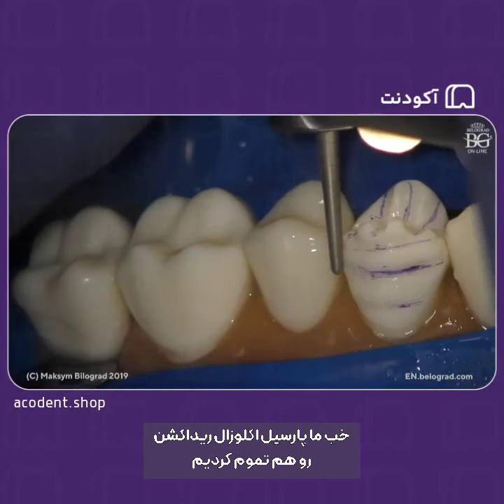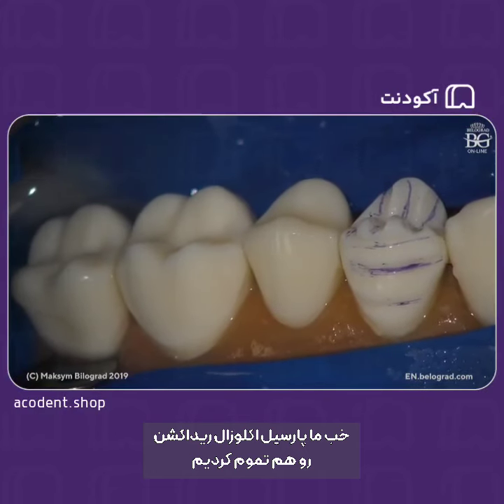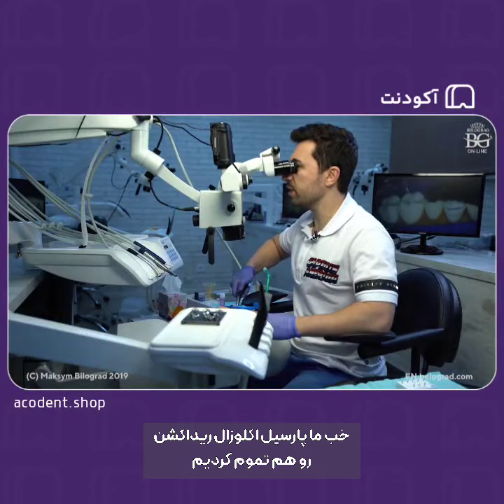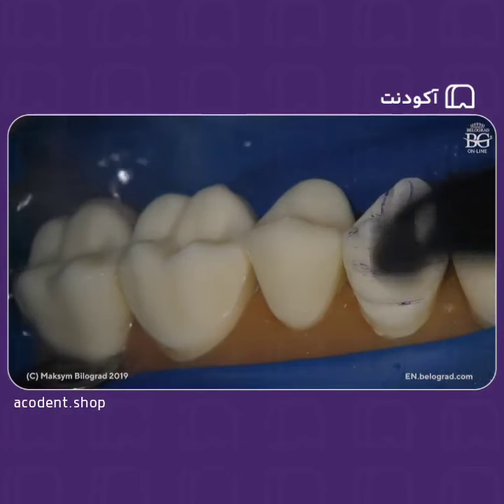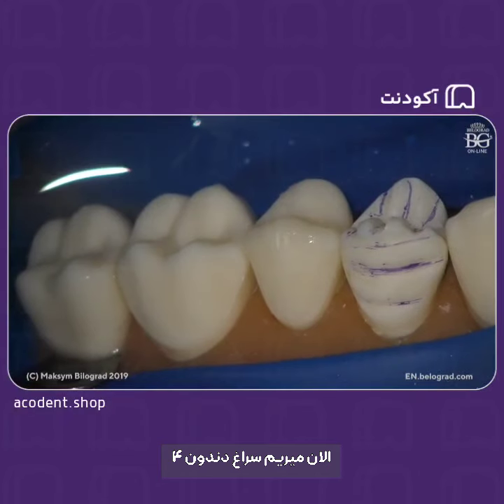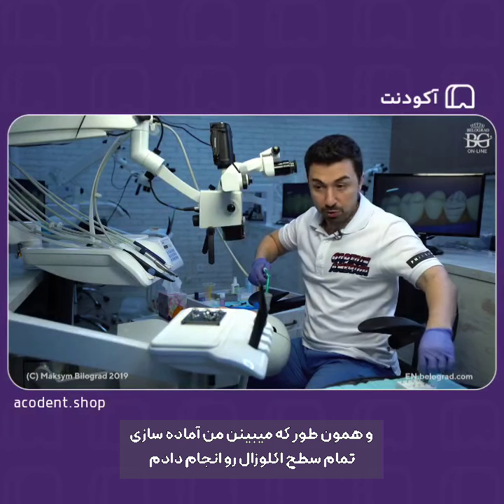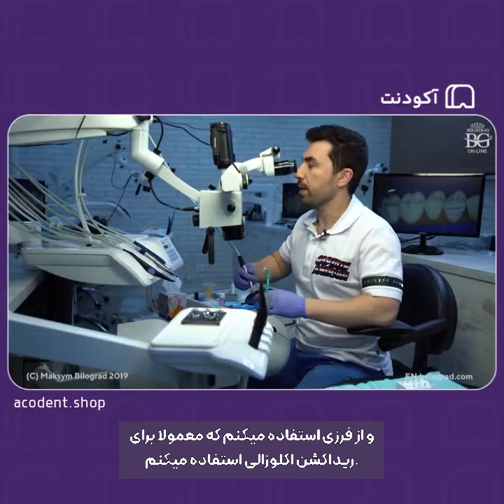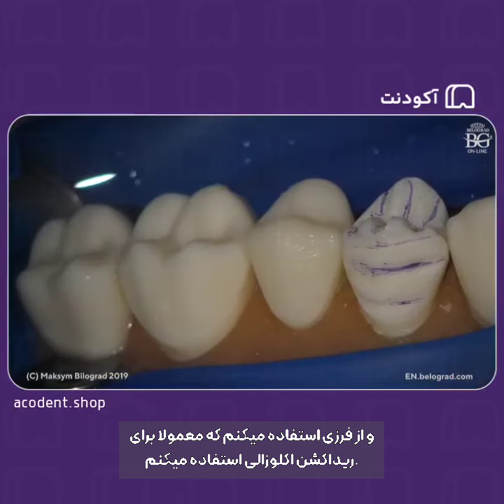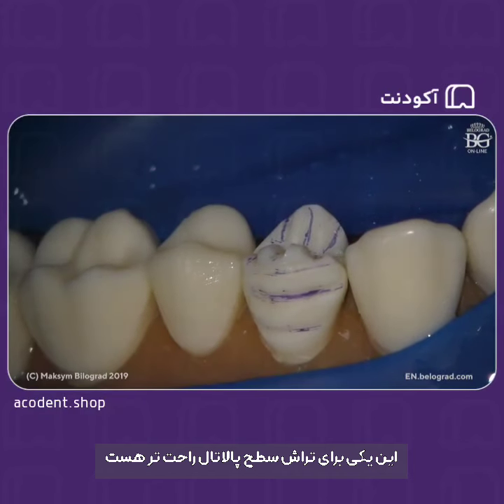Okay, and actually we're done with the partial occlusal reduction case. It's a butt joint, and we will go now to the first premolar, and you can see that I have prepped all the occlusal surface. I'm changing the burr now. I will use the one that we will utilize for occlusal reduction. This one will make it easier to prep the palatal side.